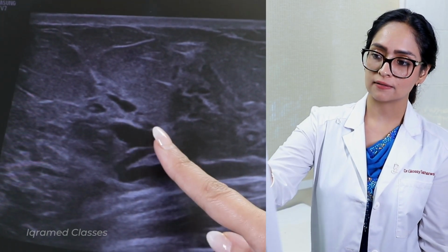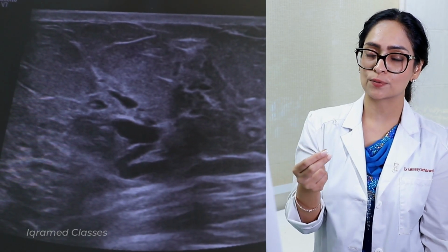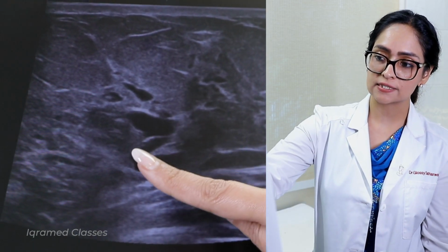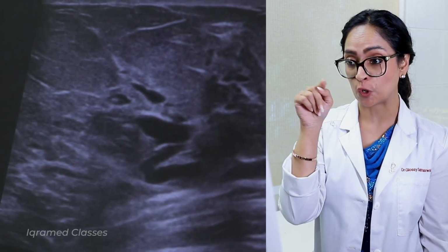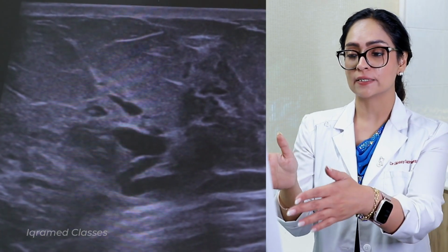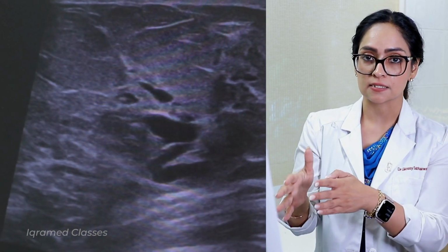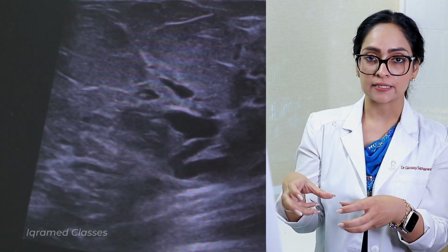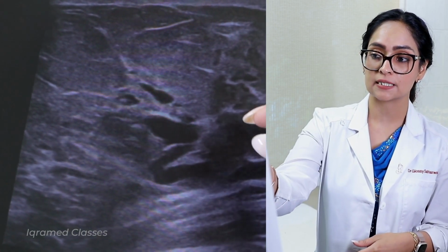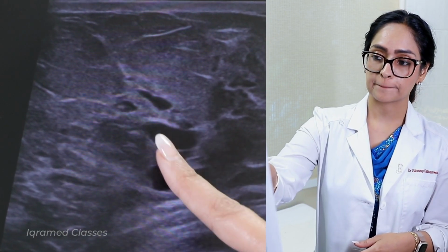What do we see here? We could palpate some lump. Actually, that was lactiferous sinus. The dilated duct in the lactiferous sinus can sometimes be confused for a mass. If that is the thing, ultrasound is the modality because it will differentiate between a solid mass and a cyst. So lactiferous sinus, which is a normal ductal dilatation, can be seen in the breast here, this area.